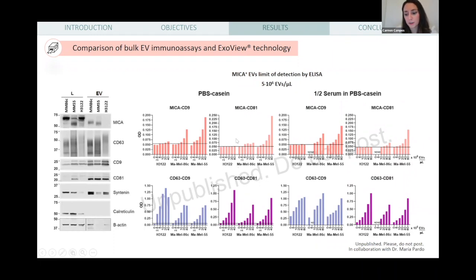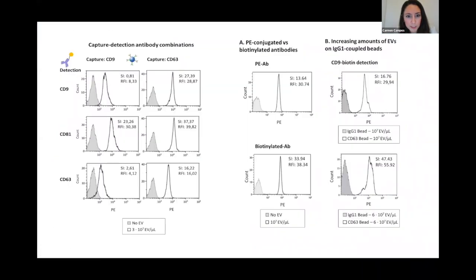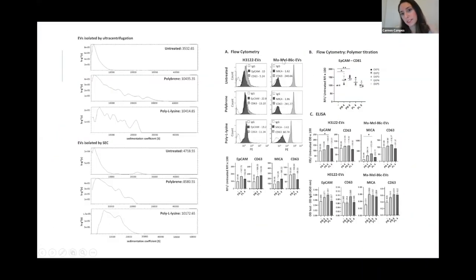Also, I think I have another slide on MICA. Just one second. Here you see, for example, these are metastatic melanoma derived EVs, and this is the abundance of MICA detecting with CD81, and then this is CD63 detecting with CD81. So you see the abundance of MICA is really low, and this is the lung cancer cell line derived EVs and the expression of EPCAM in comparison with CD63. You see that they are similar, but in the case of MICA is much scarcer.